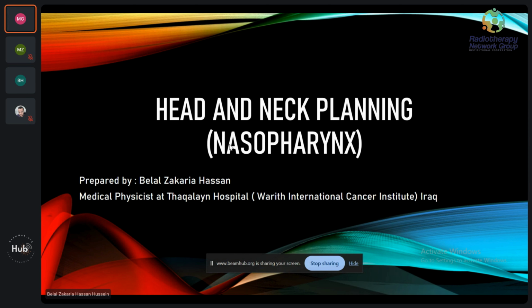Another question: you mentioned that you have lots of organs at risk to outline. Do you rely on or use any auto contour tools, like any of the ones on the market, or do you have to go through this yourself and spend a good bit of time? Personally speaking, I do it myself. I know that a lot of planning systems have now contouring atlases for the organs at risk, but I do it myself. I do trust myself.